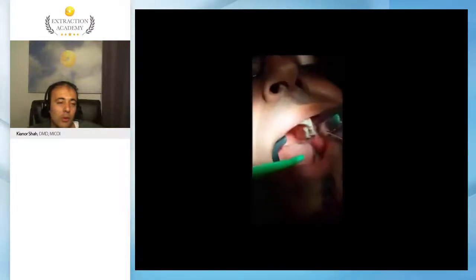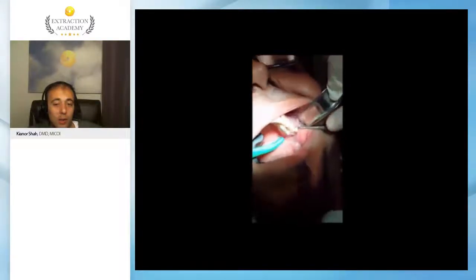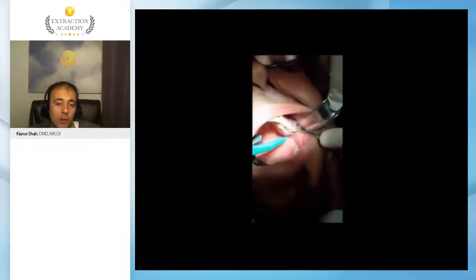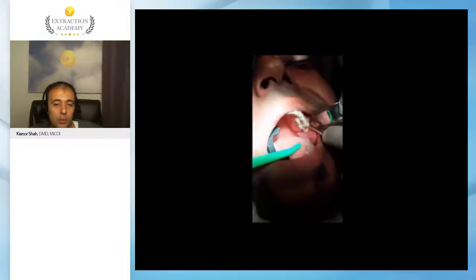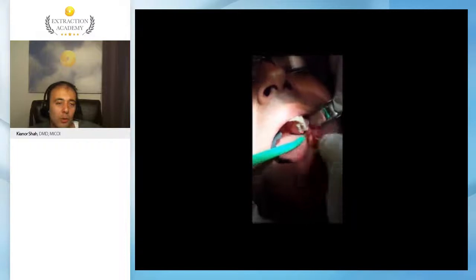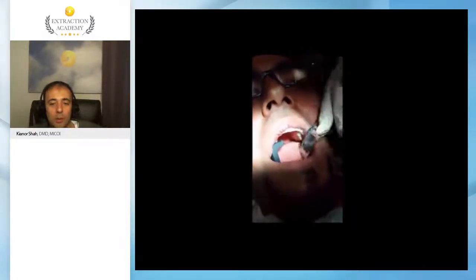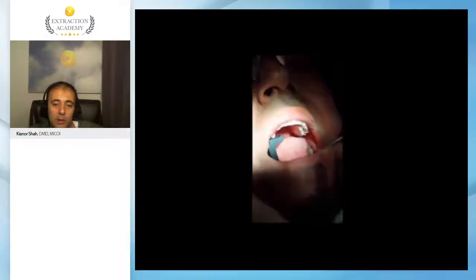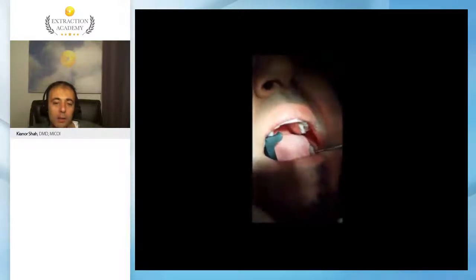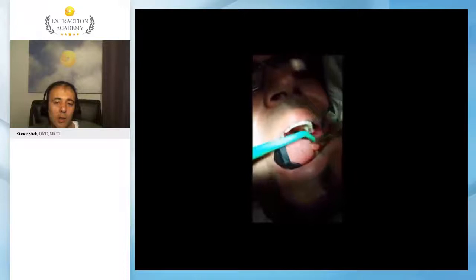After a while, you get so comfortable that you can do these in a very, very short amount of time. This is under local anesthesia, partially impacted, a couple of uppers, and it's a 2-minute procedure. If you have your elevation methods right and techniques and you know your instruments and you become comfortable with the Minnesota, take a look right there. This is the pop right there. You saw the pop. Once you have the pop, you can go back and use other techniques.